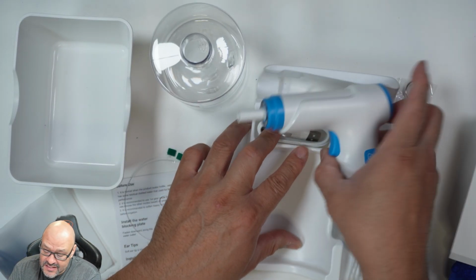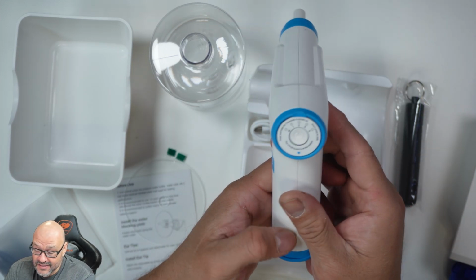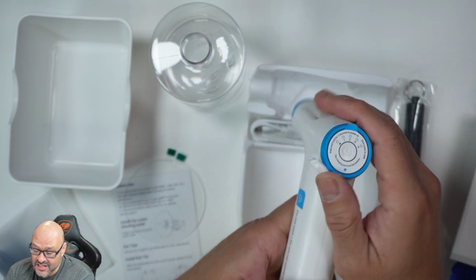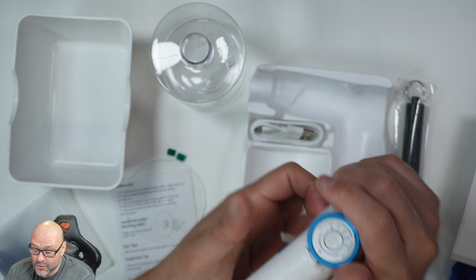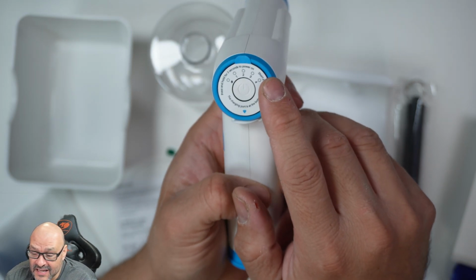And this is the actual system itself. And the pump itself is chargeable. There's no batteries necessary. So there is a charging station in here in the back. And the pressurized system is right here. There's a knob that tells you different sections.